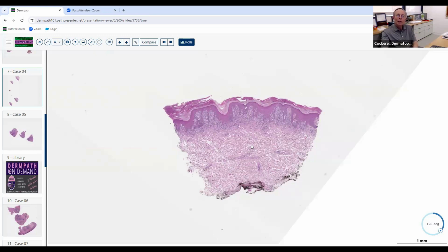Very good: lichenoid dermatitis. What kind of cells do you think we're looking at here? I think they're predominantly lymphocytes. But wouldn't they be darker and more jet black at low magnification? Yeah, I guess so. They usually are.